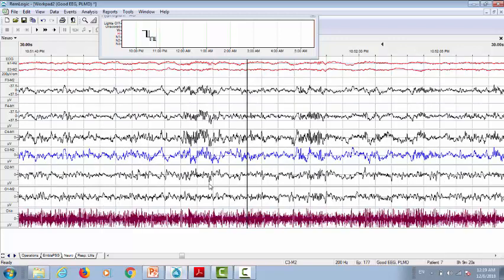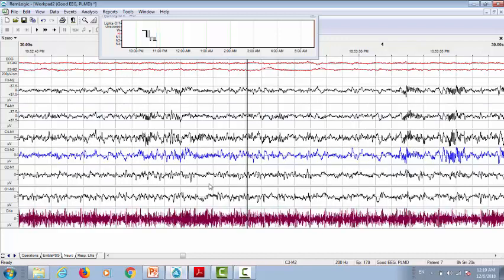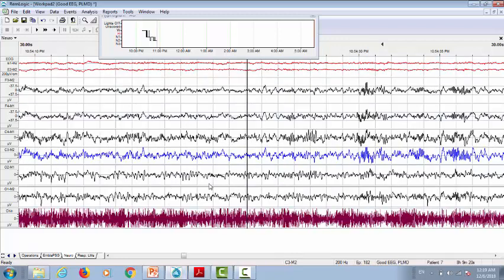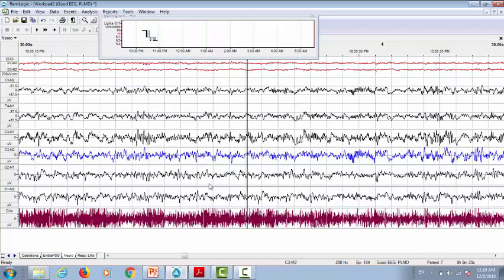No reason to stop scoring N2. Continue as N2. There is no reason to stop scoring N2.